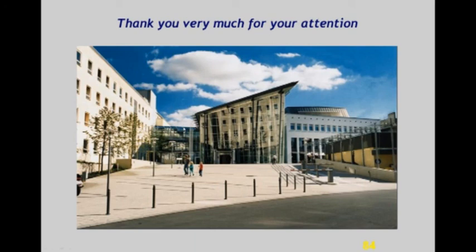If you look at individual patients, you might be allowed, according to which equipment you are using, to reduce the dosage. This is in accordance with the criteria of bubble destruction. Please be aware to use the lowest mechanical index for a stable image. And please be aware to decrease the dosage whenever there is shadowing of the image, because you would like to avoid losing the depth penetration necessary to examine the whole liver. So please try to be standardized as much as you can. 2.4 seems to be a good dosage for many circumstances. Individually, you might reduce.